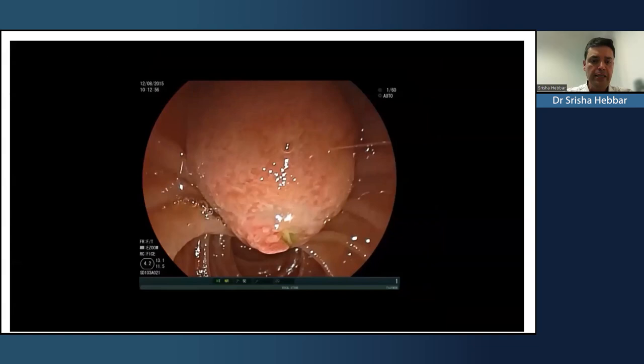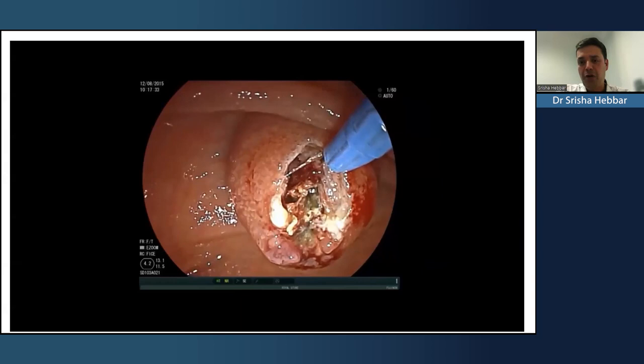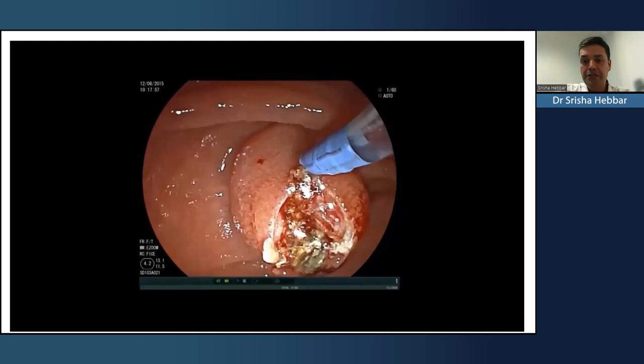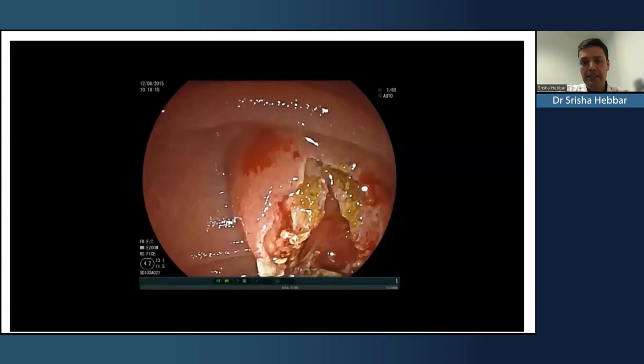In this situation, now that you've got a large ampulla, you know that there's a stone sitting just underneath that. In this situation, it's much more effective to go for a primary fistulotomy sometimes. So you can see as soon as you cut, there's a stone underneath that. And if you've never done a fistulotomy before, these are the right cases to choose because you're not going to cause any harm. You just hit the stone and you're not going to cause pancreatitis. And in fact, in this case, the stone was delivered with the needle.